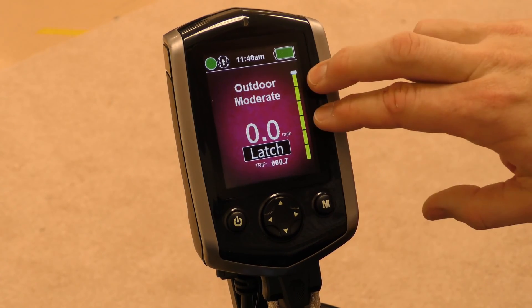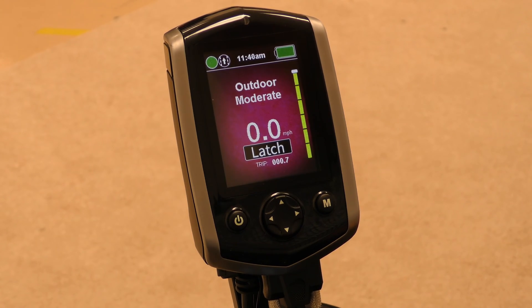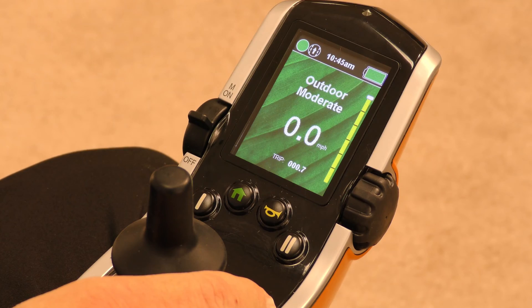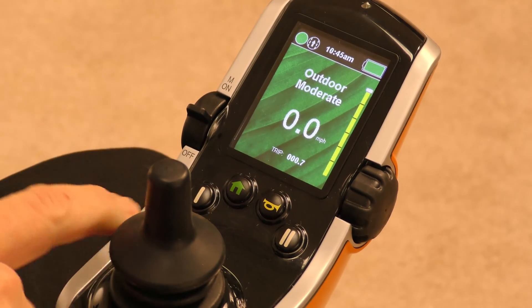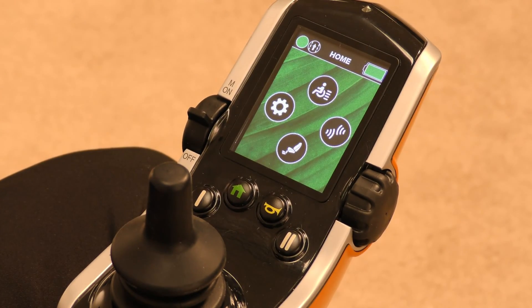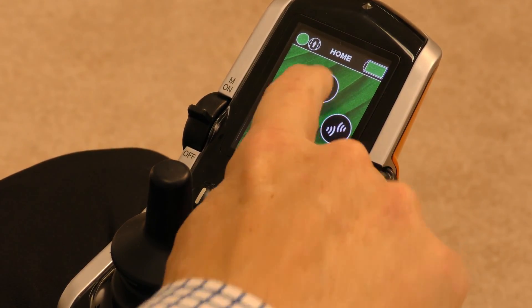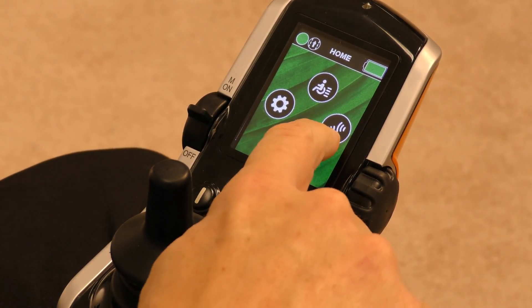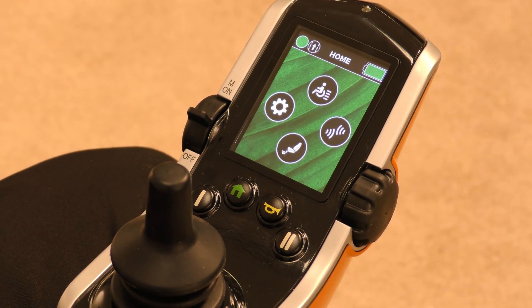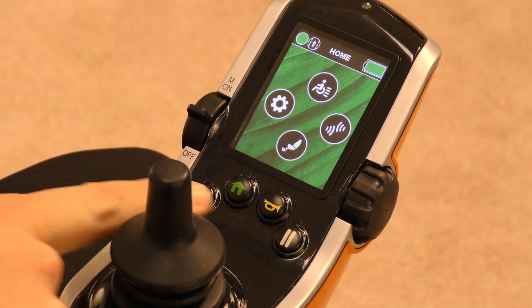It's more out of the way and still easy to see and understand. On the Q-Logic 3 hand control, there are some new features available. There's the home button, which will always take you to a home screen providing a shortcut to your drive profiles, your seat profile, your auxiliary profile, or your settings that you have access to as the user of the wheelchair.